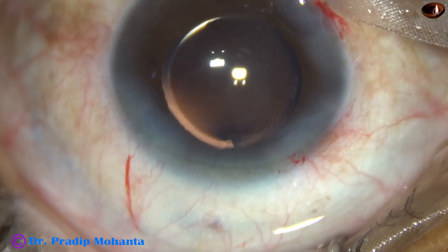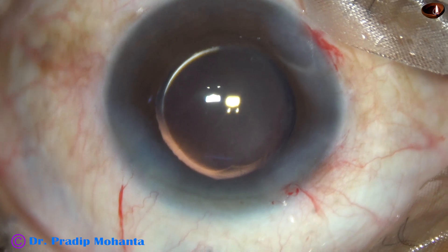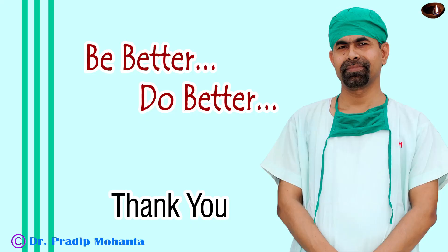The anterior chamber is nicely formed and the case is concluded. Thank you very much for your attention. Hope this video will help you in developing your surgical skills. So, in soft cataracts, you can just tilt the lens — which is just like an idli — and just eat off the idli.